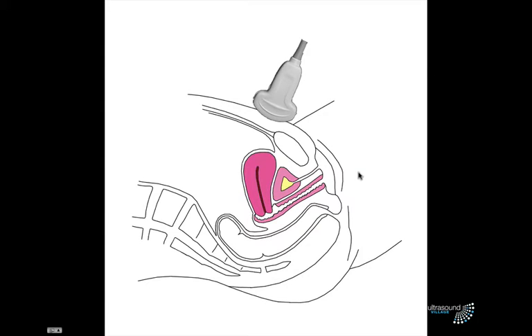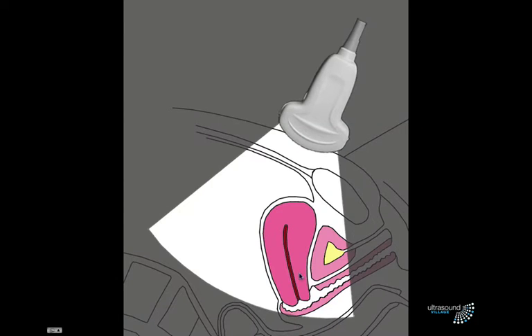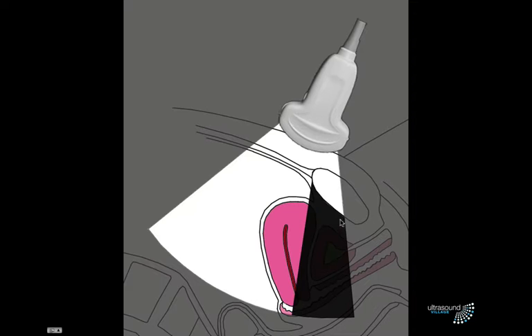You begin by doing a longitudinal examination of the uterus, and you pop your probe on in the longitudinal position. This is what you'd see. So we zoom in on that. So you should, hopefully, see the uterus, the vagina, the bladder. But, unfortunately, we know that behind bone, one of the enemies of ultrasound, you get shadow, and you can't see what's behind bone. So, with a probe like this, you see black there. So that cuts out your bladder and the vagina and a little bit of the uterus there.